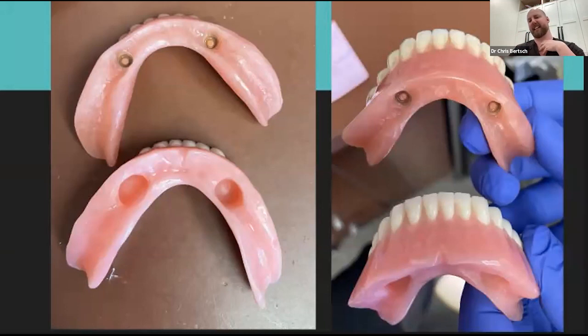And the other thing also is that when you do this, or any denture adjustments, make sure you polish after. I've had a few patients come back where they've had a reaction to the acrylic, and it's not obvious at first. It wasn't for me. And then I was like, oh, I just forgot to polish it. So get a denture adjustment kit with some polishing cups, and make sure it's nice and smooth when you're all done.